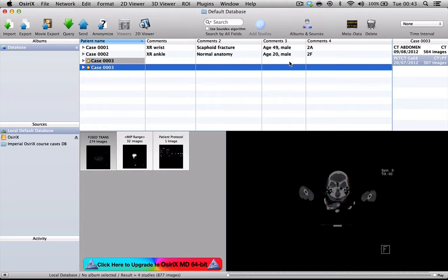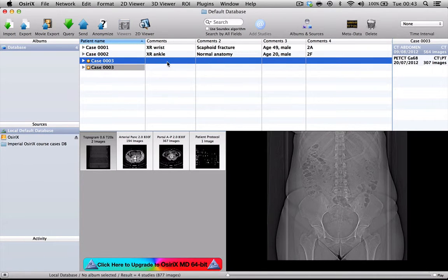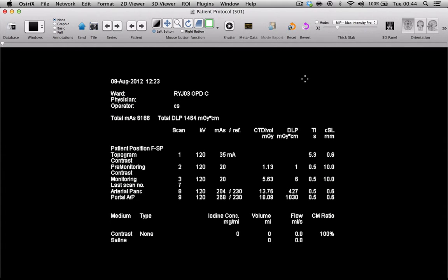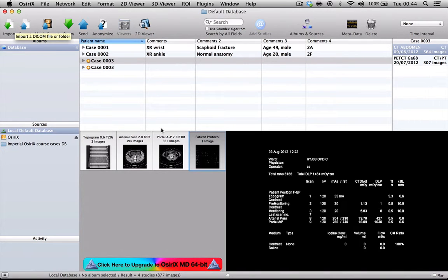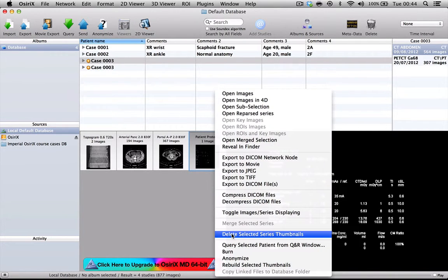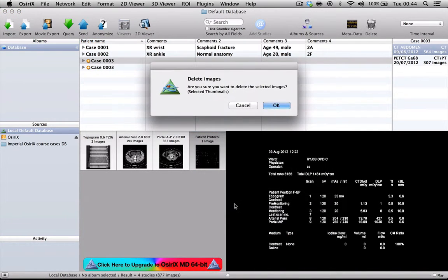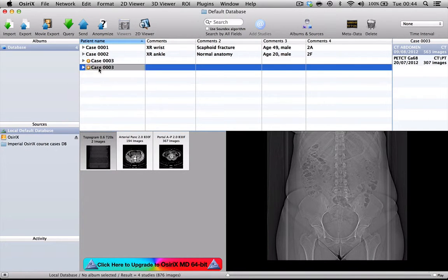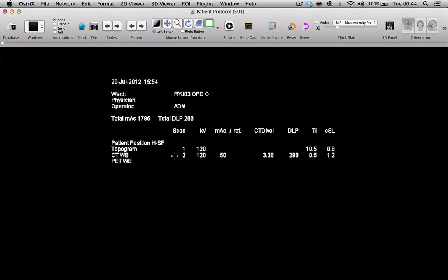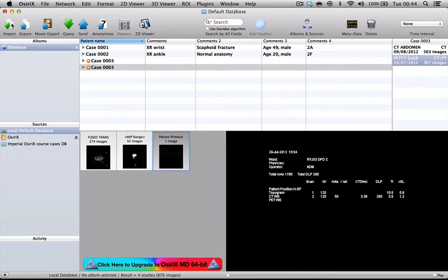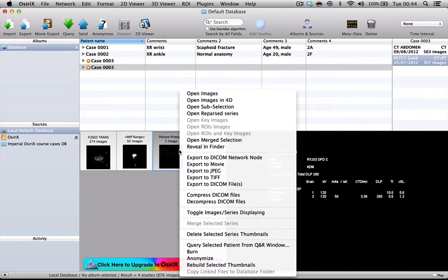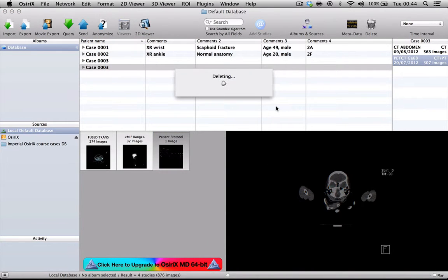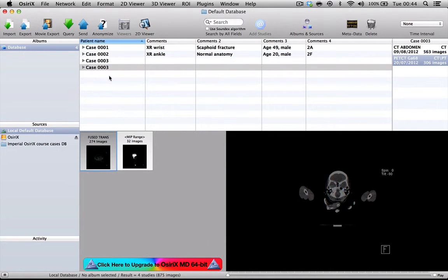The final thing that I need to mention is that when you're looking at CTs, it's very important to check the patient protocol sheets because these very often have the patient's name and can undo all the good work that you've done with anonymization. I've actually deleted the patient name from this protocol sheet. My advice to you would be that on these large studies, find the patient protocol sheets and delete them so that you're not going to inadvertently give patient information away. So there's another one that we need to delete.